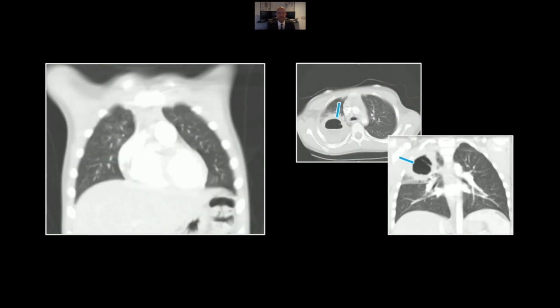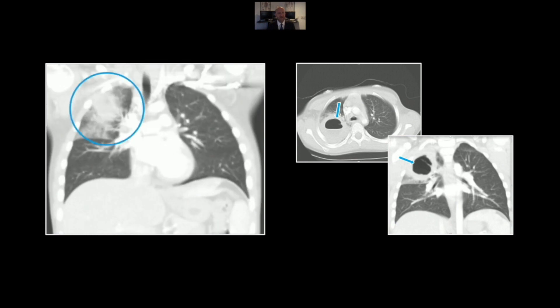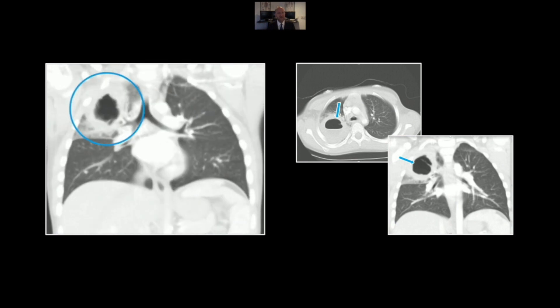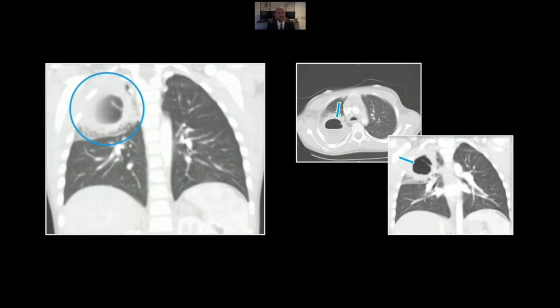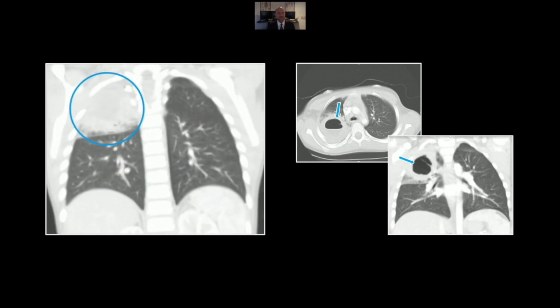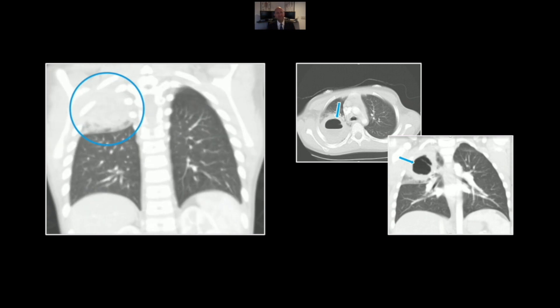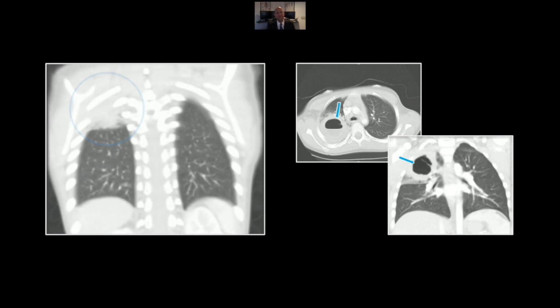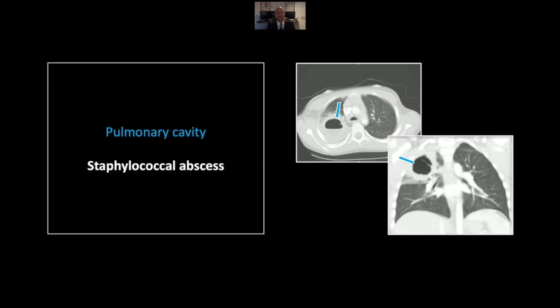Here it is on the coronal as well — you can see the layering fluid very nicely there. That is a case of a staphylococcal abscess.